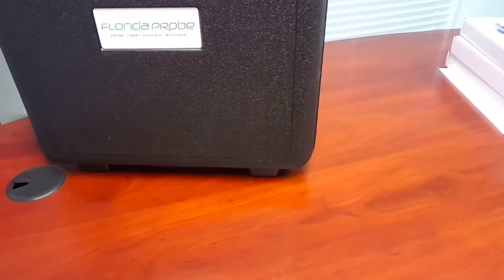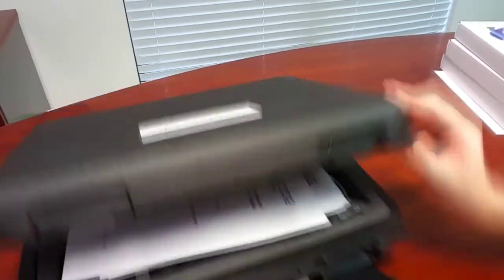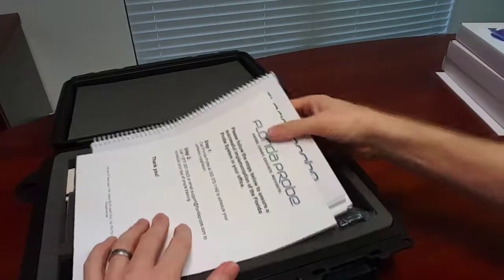The Florida Probe system comes in a briefcase-like box with two clasps on the front that hinge open. Let's take a look inside.